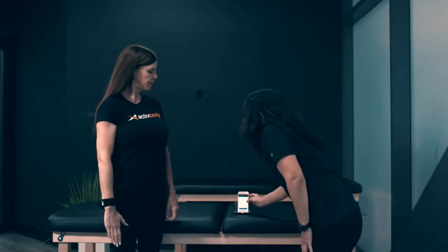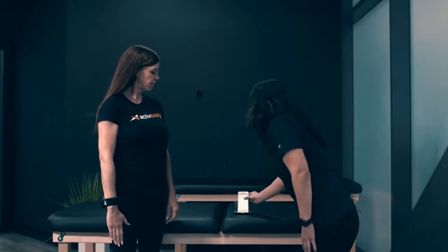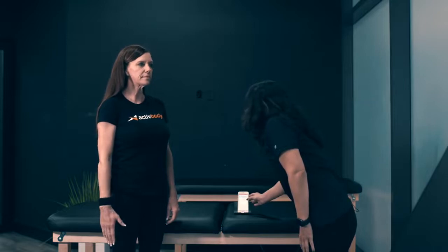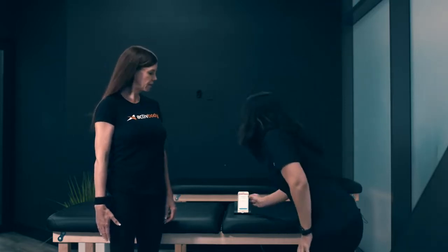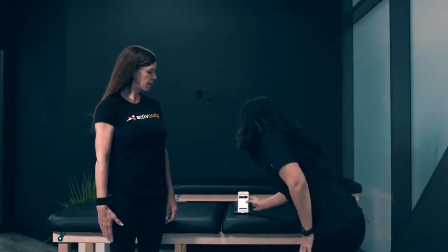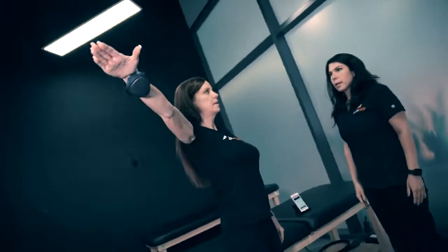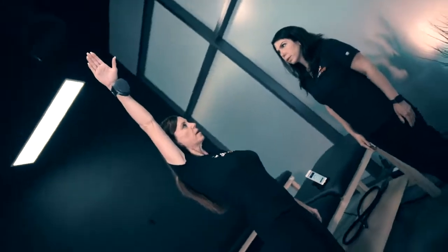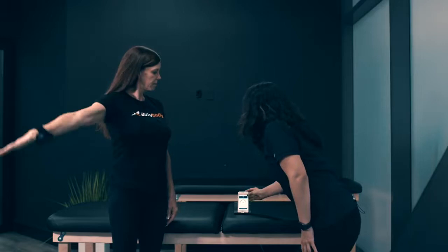The next test we're going to do is going to be abduction. We're going to do abduction of the right arm. You're going to bring up your arm as high as you can, stop at the level of pain or discomfort, and then we can end the test as well. And start. It's going to take a few seconds. As high as you can. Stop when you have any pain or discomfort, and then we're going to end the test. And we're good.